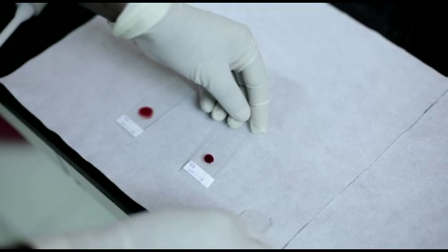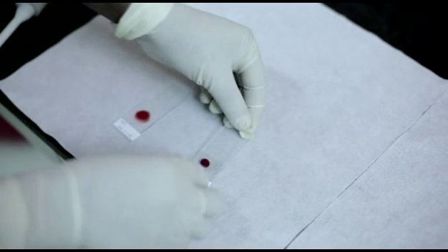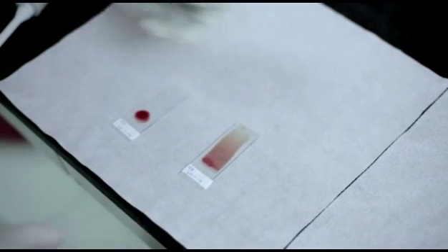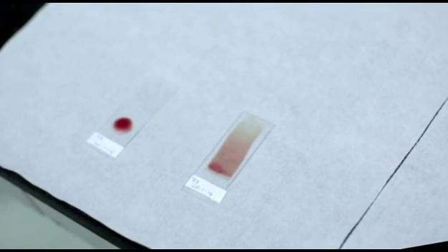Place a drop of blood on the specimen slide. Keep a clean spreader slide at a 45-degree angle towards the drop of blood and wait till the blood spreads along the entire width of the spreader slide. Now, push it forward rapidly and smoothly. Keep it aside for air drying.